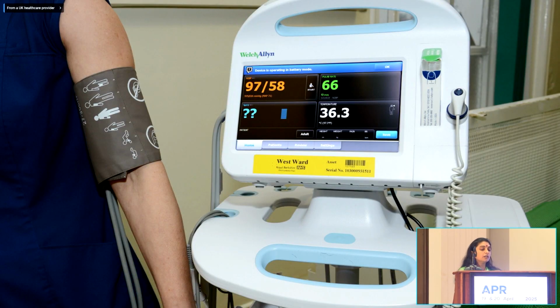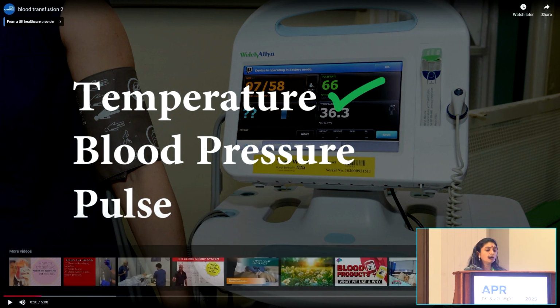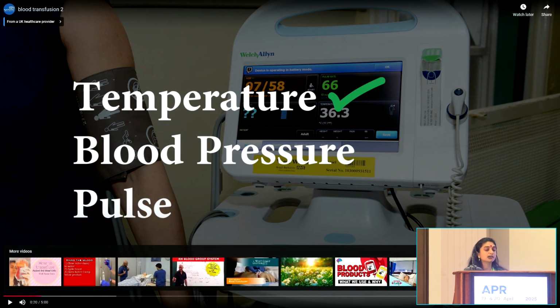This video will show you how to safely administer a unit of blood. So, temperature, pulse, BP, respiratory rate, all are mandatory checks as far as the initial transfusion process is concerned.